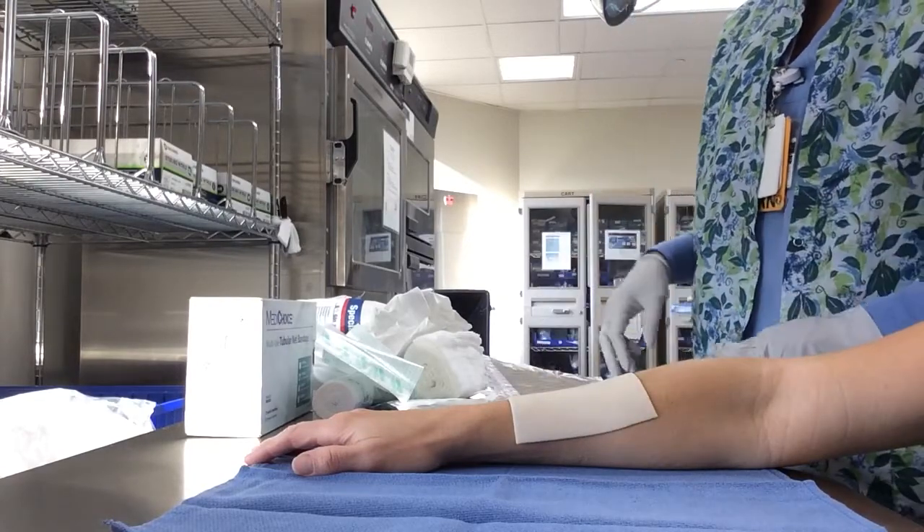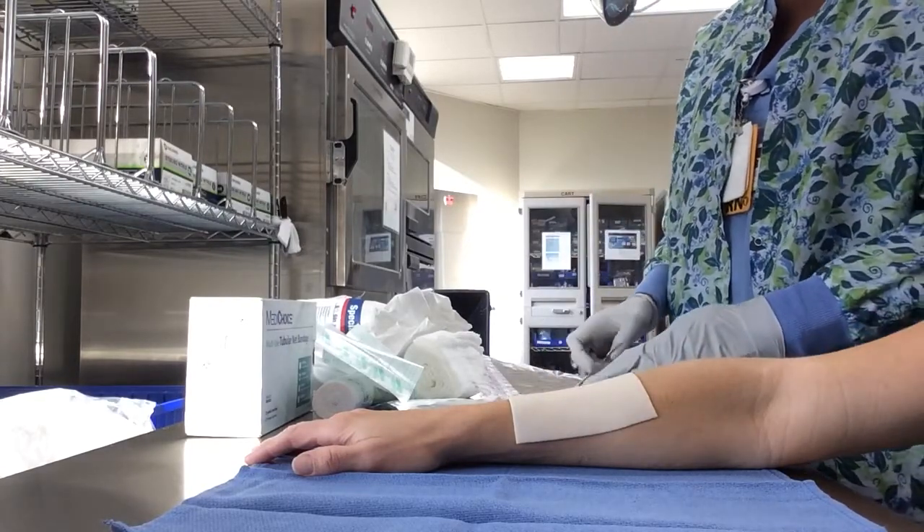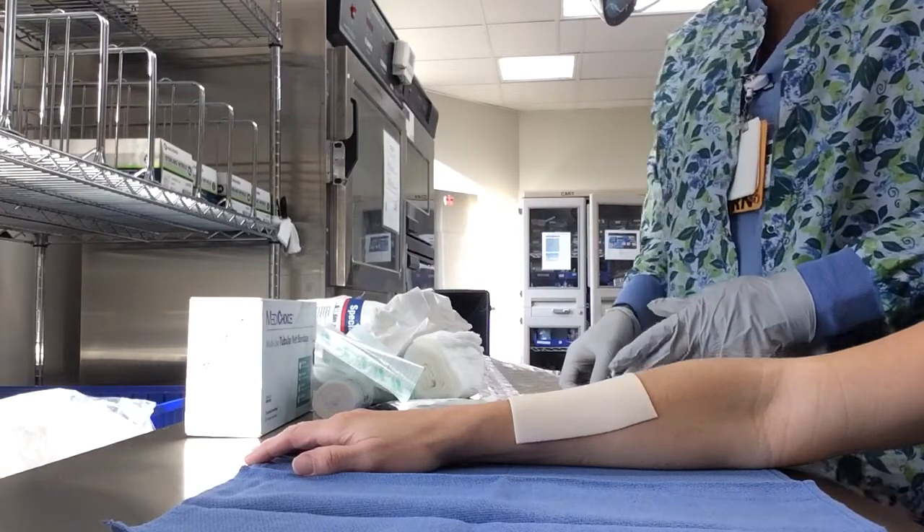Then you would do your outer dressings, which could be cast padding, ace bandage, or stretch netting.